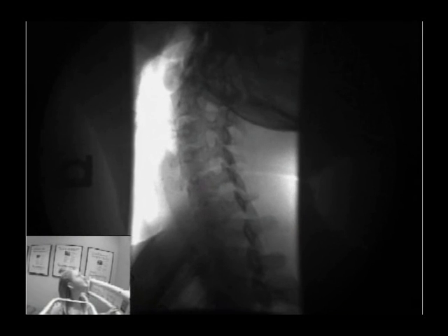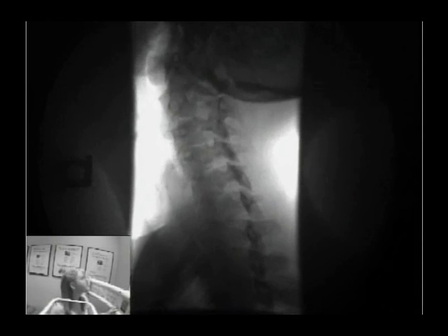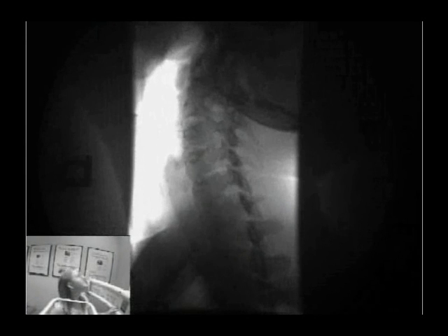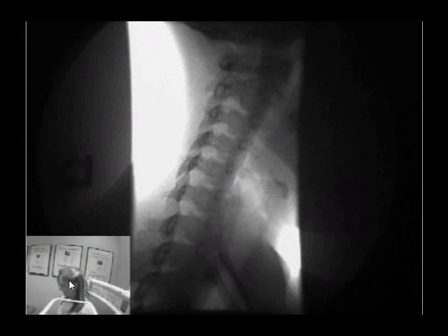In a minute we're going to look at the opposite side. Like all projections, we do this three times. You'll notice in just a moment we're going to turn the patient so she's facing the opposite way, and we'll be looking at her left facet joints. This is completely the opposite side, and before she really even brings her chin to her chest, your eyes should be able to go right to that big gapping of the facet joints.